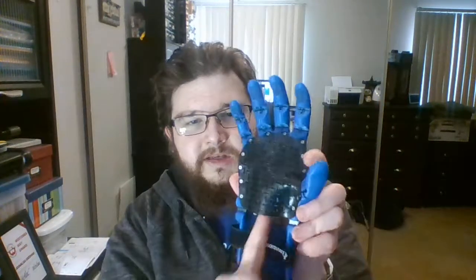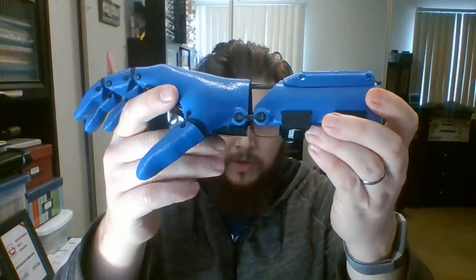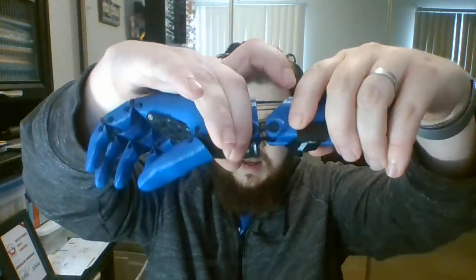I have also printed out a full set of palm spacers to accommodate palms that might not fit all the way up into the device. Function-wise, I followed the assembly instructions and the hand is open when the palm is parallel to the gauntlet, and there is a very narrow angle to flex the hand.